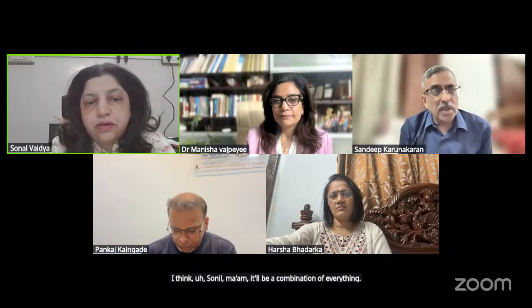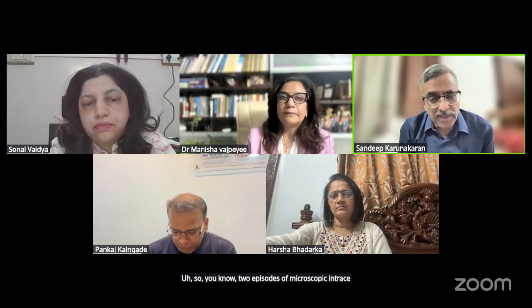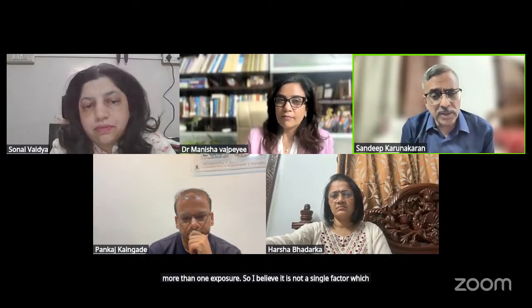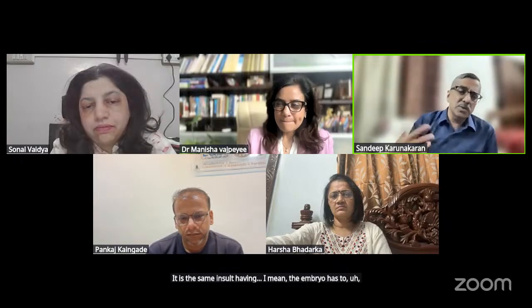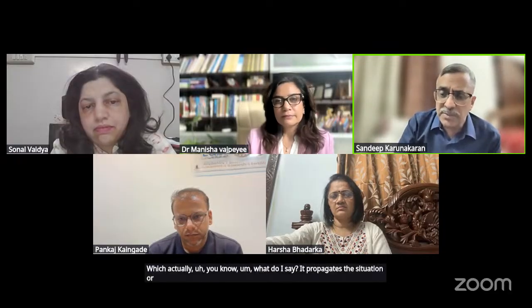Sonal ma'am, it will be a combination of everything. Two episodes of microscopic intracellular ice crystals would possibly add up. Two episodes of exposure to cryoprotectants might definitely harden the zona more than one exposure. So I believe it is not a single factor which causes the harm. It is the same insult, but the embryo has to bear it twice rather than once, which propagates the situation or damages it even more.